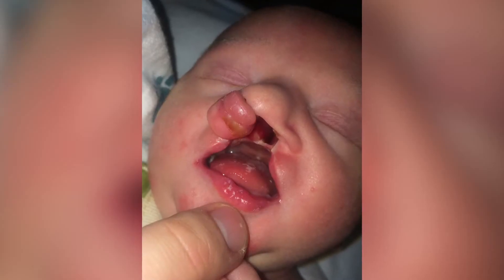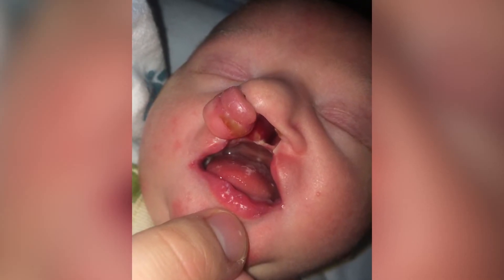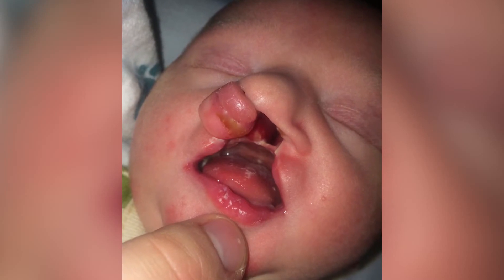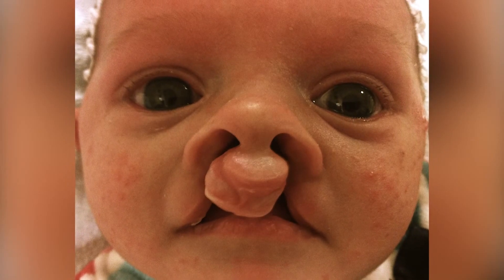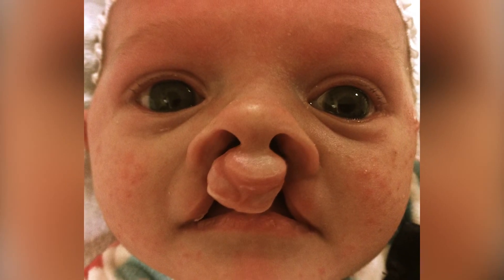The progress that we've seen with the NAMM has just been incredible. When she was born, the premaxilla and her upper lip were all the way up in her nostril — basically her mouth was shifted to the right because it was so sealed up. The NAMM has moved it all the way to the middle and moved it back, and it's been unbelievable to see. You can just tell that her results are going to be so much better.